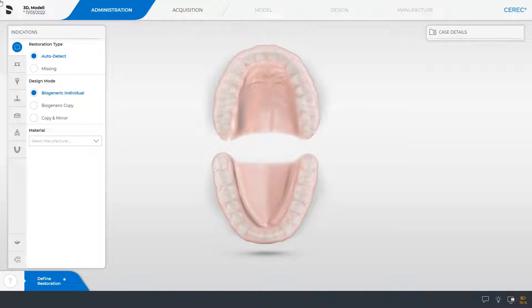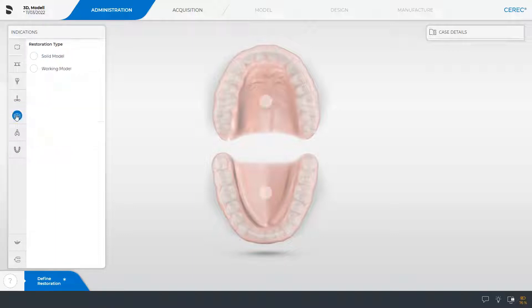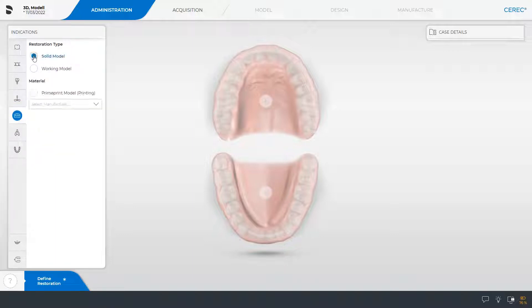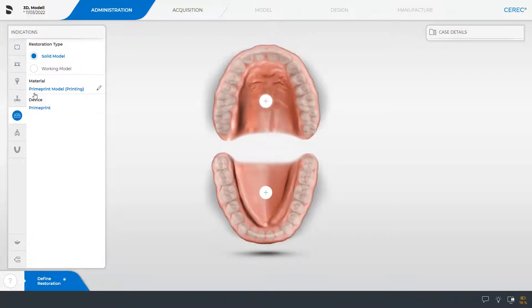We start in the administration phase in the CEREC software and select the model indication. We tap solid model, select Prime Print Model under material, and mark both the upper and lower jaw.